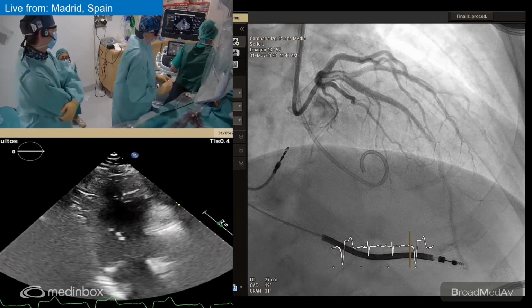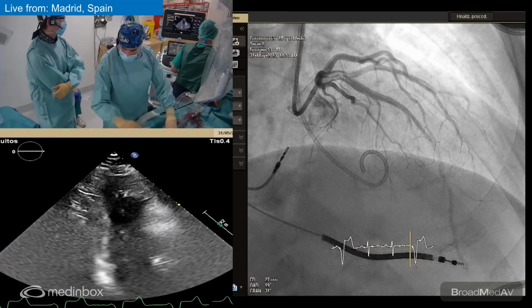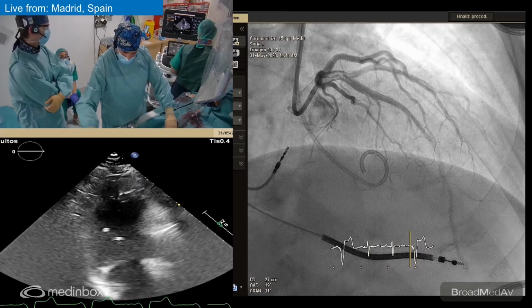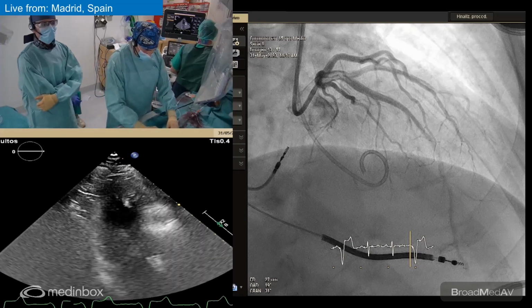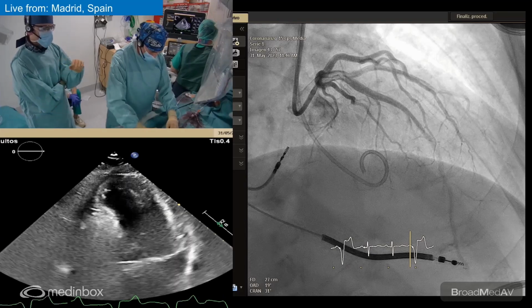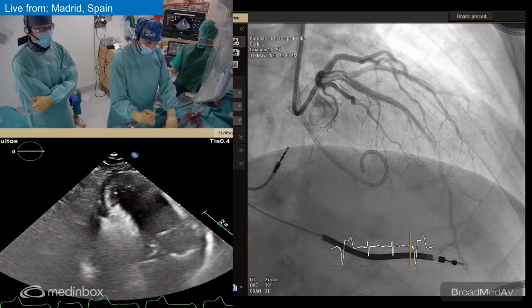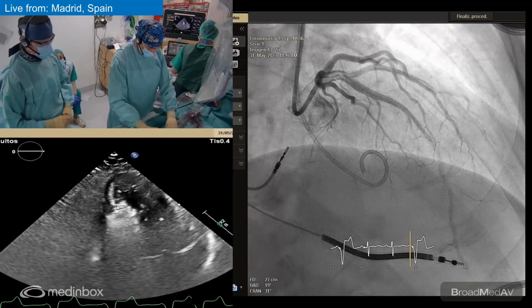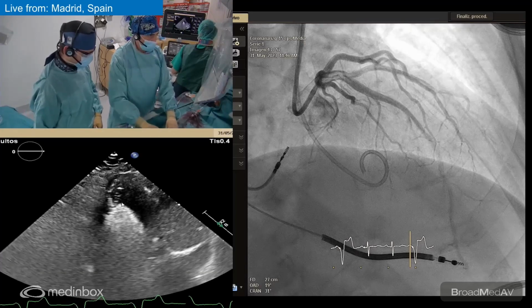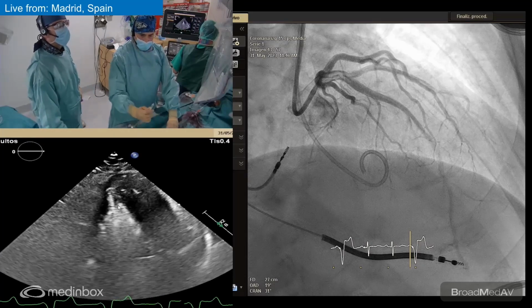Yeah, in the echo, you can see that we have almost reached the apical septum. So I would definitely not go any farther to the fourth septal. For sure, this is a special case. We usually focus on the very basal septum, but now in this mid-ventricular gradient, with a very big septum, we have changed the usual. You see, this is the problem. You cannot choose the anatomy. The anatomy is an uncontrolled factor.